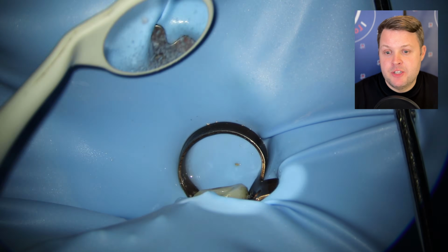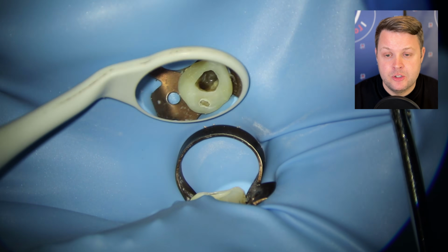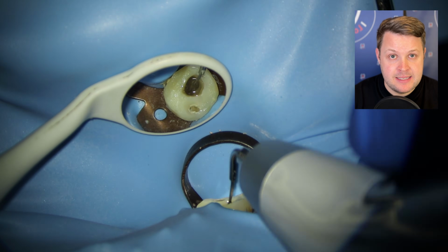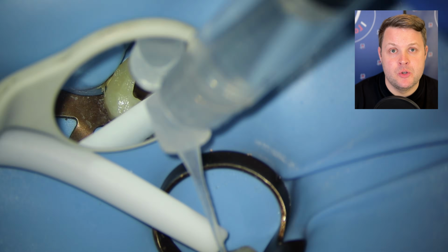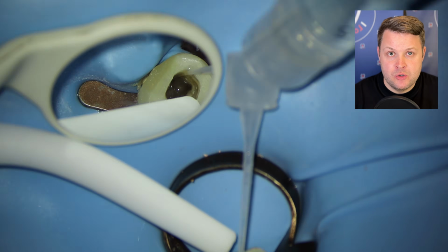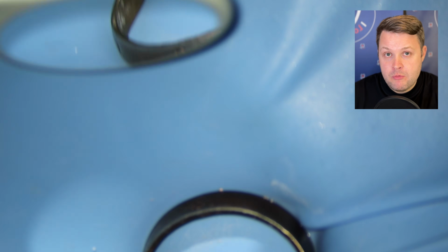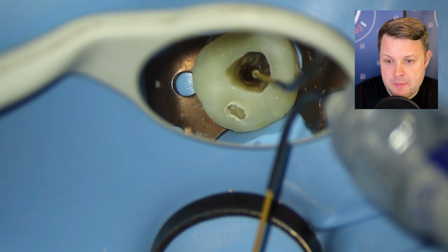Our final irrigation protocol: we're going to remove the GP cones and put them in a disinfector, because remember, the GP cones aren't disinfected. We're going to do a first rinse with activated sodium hypochlorite, a second rinse with EDTA to open up all the tubules, and then a final rinse with sodium hypochlorite just to get it into all those nooks and crannies, and it's all going to be activated. Then we're going to dry with paper points, and then we're ready to obturate the tooth. I'm going to do a slightly different technique with the palatal.